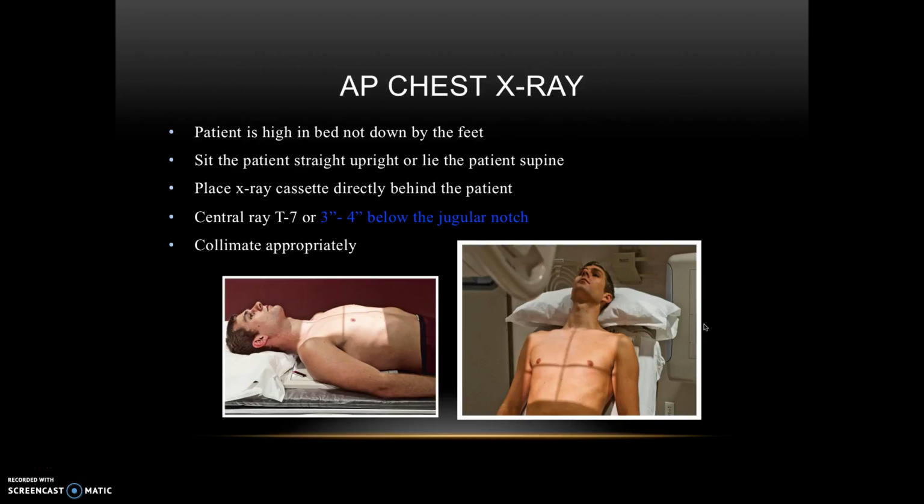So sometimes you're going to have a patient that cannot stand, they can't walk, so we have to work around that. We have to get images still and work in the current patient situation, and we're going to see this every day in a hospital where the patient can't get up. We're going to work with them to get an x-ray. So this is going to be an AP chest x-ray.